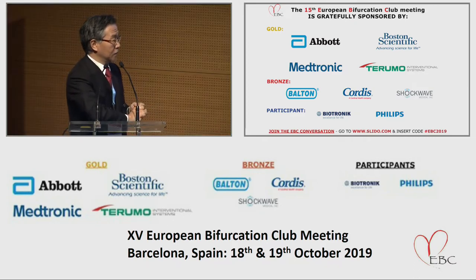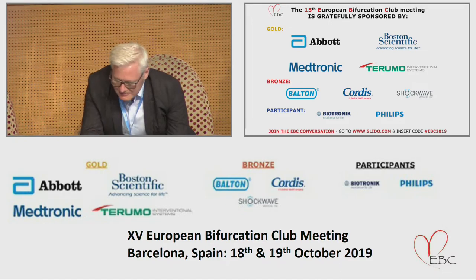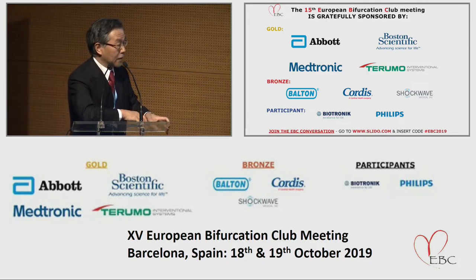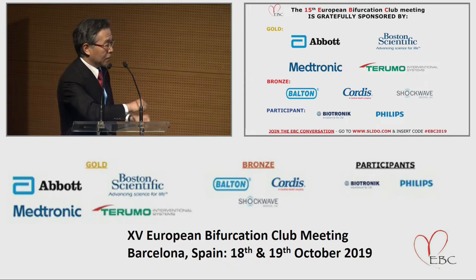Short practical question, short response. When you position the edge of the stent in an intermediate plaque burden, say between 40 and 50%, how do you size the stent: according to lumen, media to media, halfway? What is your policy? People are asking this question frequently. According to our daily practice, lumen-based stent size selection, because more complex regions are included in daily practice. If we can see the EEL clearly, we decide by the EEL.